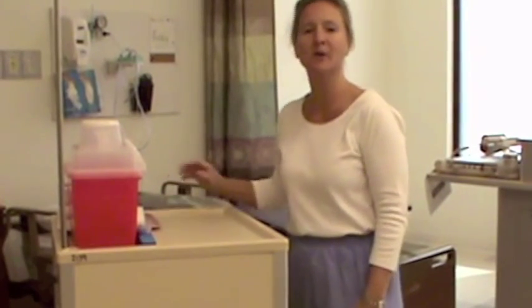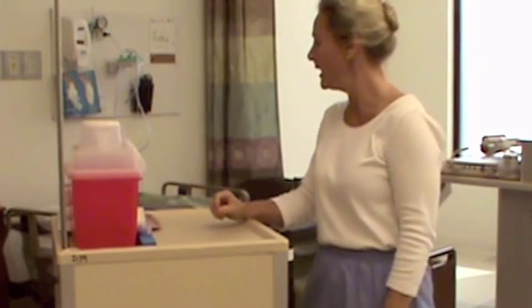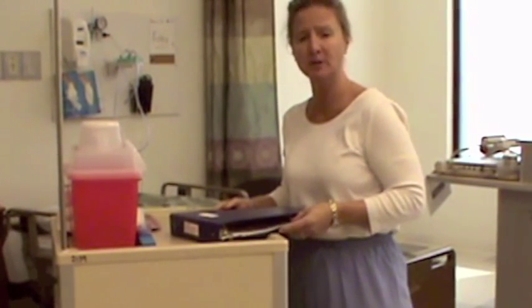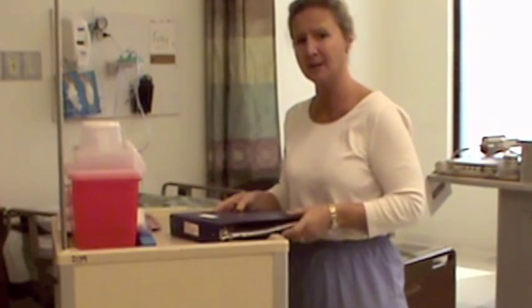Okay, today we are going to be introducing intramuscular injections, and I have a patient, Mr. Hoshi Ito, who right now is complaining of nausea, and he has an intramuscular injection of Tygan to treat his nausea. I've already seen him, and I know this because I've checked the MAR before.